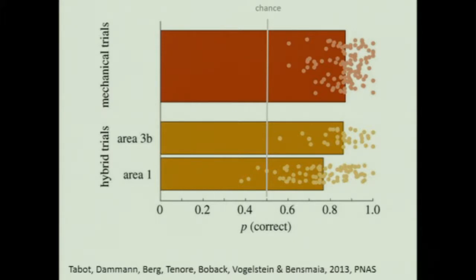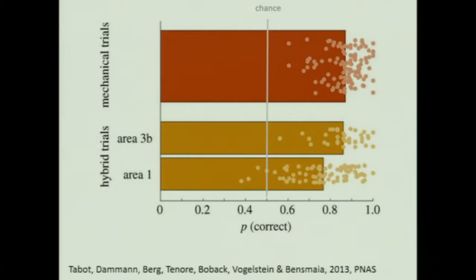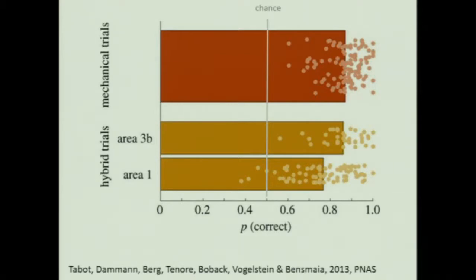This is the performance when we replace one of the pokes with an electrical stimulus applied to area 3B, right? That's really primary somatosensory cortex proper. This is the cortex that first receives input from the hand. Area 1 is sort of a second area, like a higher level area. Each of these points was associated with one of these locations. For every receptive field that we got in 3B, we would pair it with a mechanical stimulus there. And you can see that the performance when one of the mechanical stimuli was replaced with an electrical stimulus applied to 3B was nearly as good.